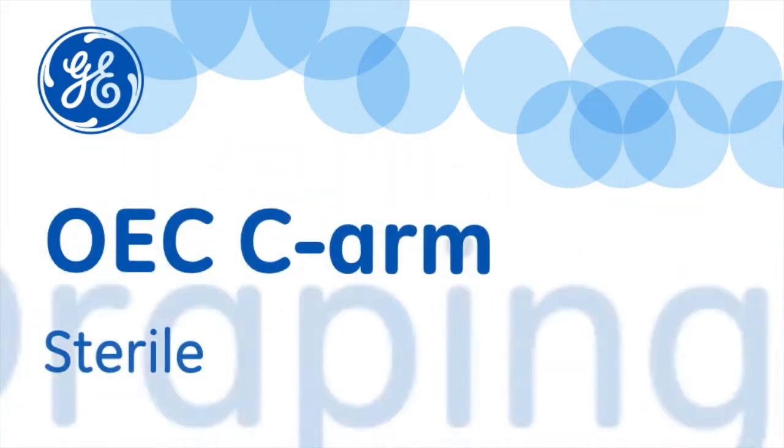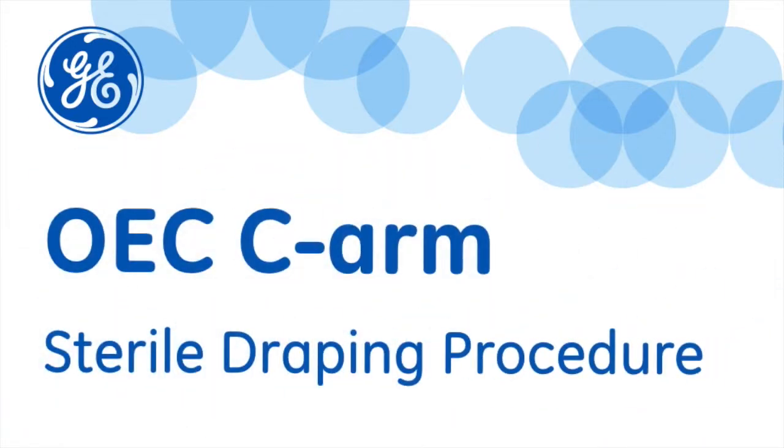The objective of this video is to demonstrate the proper technique for applying the sterile drape to the OEC 9900 C-arm by a scrub tech or nurse.